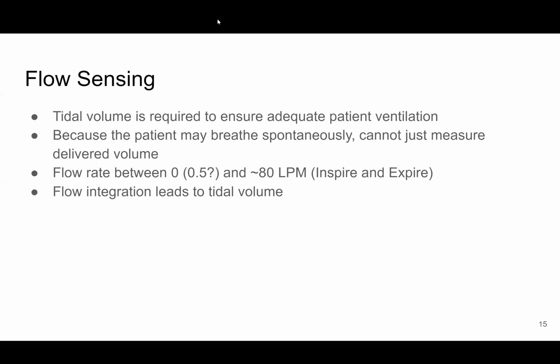And again, missing those edges could be okay. It decreases your accuracy, but obviously we don't want to do that. But if it totally simplifies the system to have a slightly less accurate volume integration, the volume is not a hard number. It's going to be patient lung dependent, and so if you're 5 milliliters over, you should be okay as long as you're monitoring other parameters, or if you're indicating 5 milliliters over.